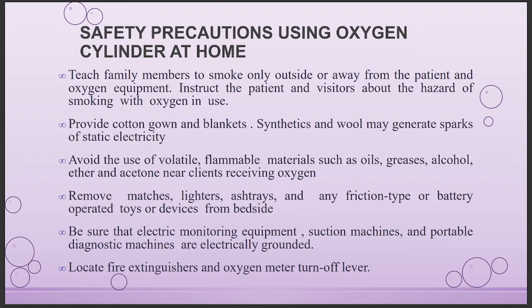Teach family members to smoke only outside or away from the patient and oxygen equipment. Instruct the patient and visitors about the hazard of smoking with oxygen in use. Provide cotton gowns and blankets. Synthetics and wool may generate sparks of static electricity. Avoid the use of volatile flammable materials such as oils, greases, alcohol, ether, acetone near clients receiving oxygen. Remove matches, lighters, ashtrays, and any friction type or battery operated toys or devices from the bedside.